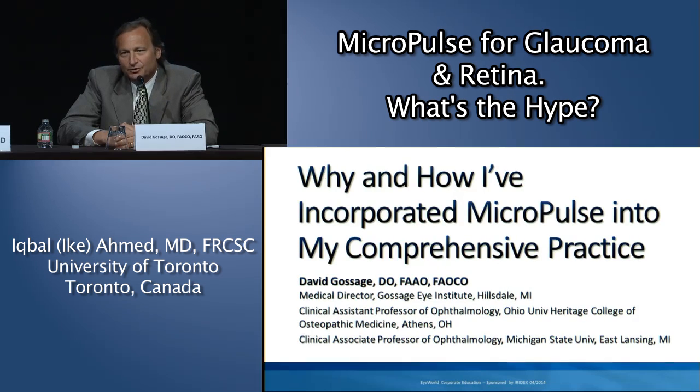From my standpoint, I really like the fact that from a compliance issue, you know that if you treated them and you get a nice response with the MLT, that patient's going to be well treated and keeping their pressure down. As we know from the glaucoma laser treatment trials and also the ocular hypertension trials, lowering the pressure is the key in saving vision. And so if I know that compliance is not going to be an issue, that's a big thing for me.